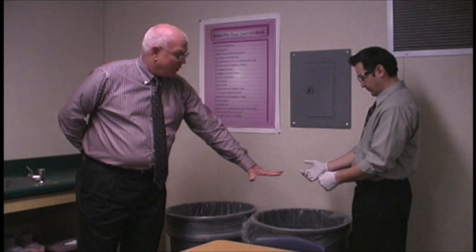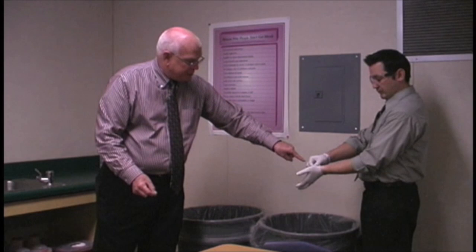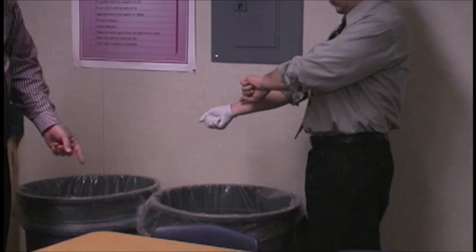Al reaches to the top of one glove — not the very top edge, but just slightly below the corner — and pulls the glove down all the way off his hand, turning it over and wadding it up. He then comes under the remaining glove with the other finger, pulls it over the top of the wadded first glove, and disposes of both gloves.